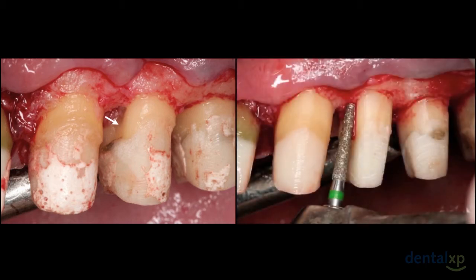Upon further treatment, what I'm going to do, and I always start with using my burrs first, is I'm going to take a C847-016 burr from Axis Dental Company. It is an end cutting burr with coarse diamond grids on the surface. It has minimal taper, somewhere around 4 degrees.